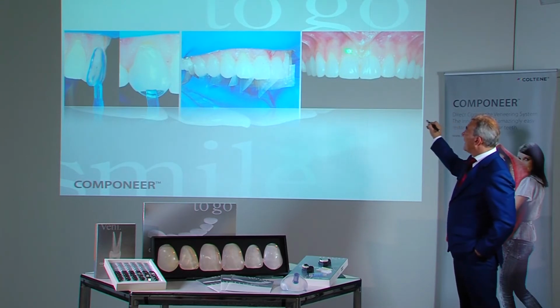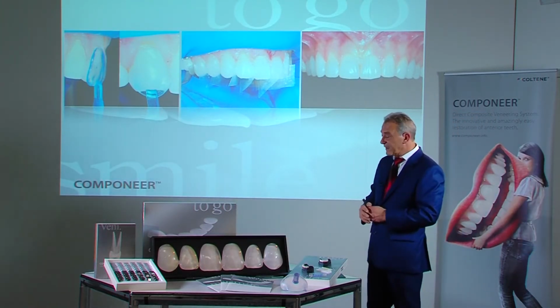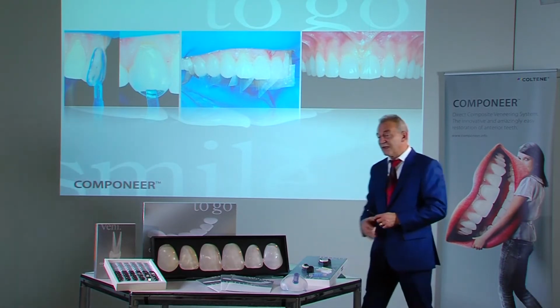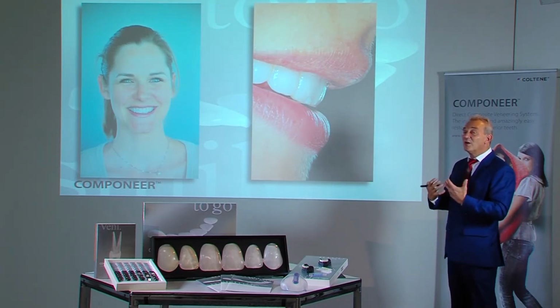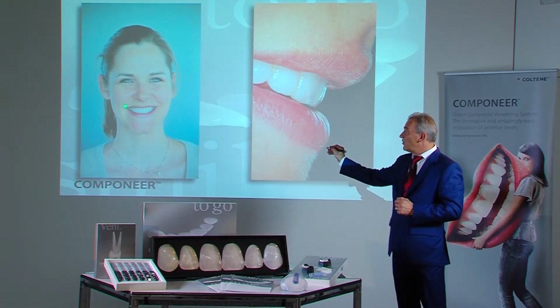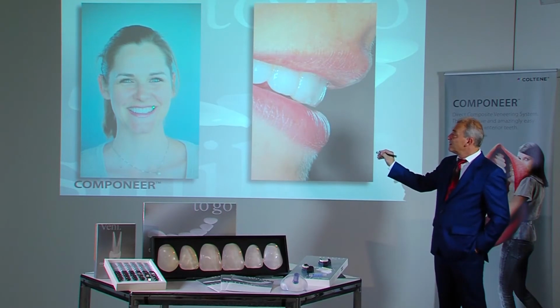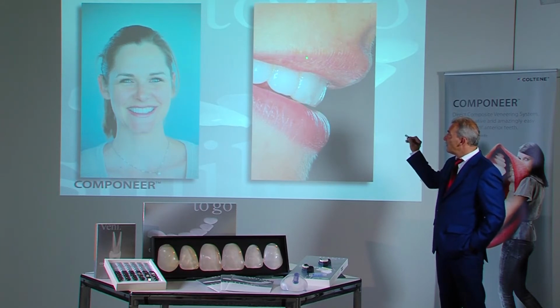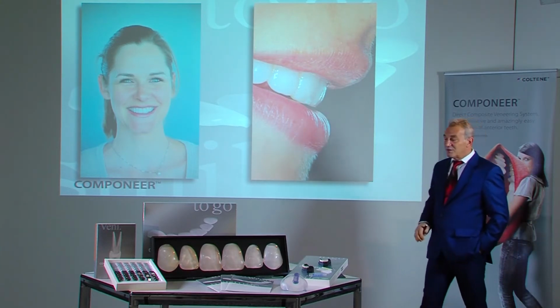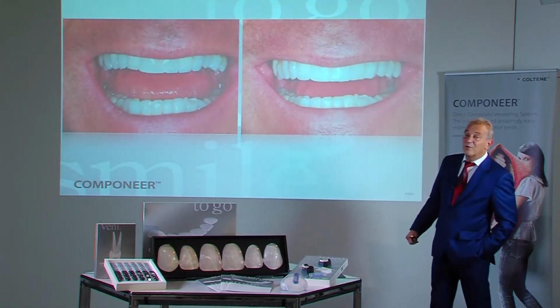The Componeers have now all been placed. At the same time, the teeth in the cervical region are extended and covered to give a certain natural appearance. Hence, the proportions are also maintained when smiling. It also proved positive to move slightly outwards to the left and right with the premolars to extend the dental arch. The tooth contours are now completed again and covered. And this results in a resistant and natural tooth surface. And to be precise, these are Componeer surfaces.